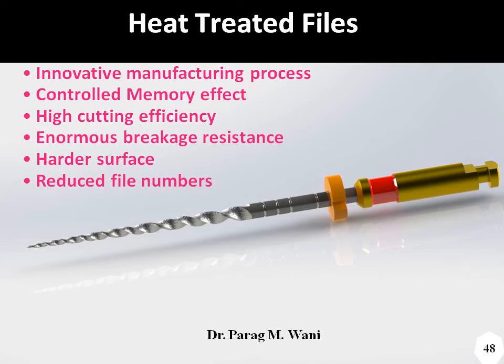Heat treated files have definitely added a lot to an endodontist's armamentarium. The pressure of negotiating curvatures and cleaning the canal to the same shape as it was before is the greatest challenge, which is solved by the heat treated files.